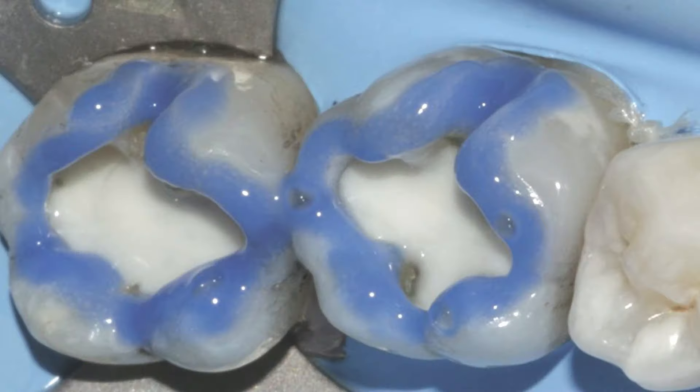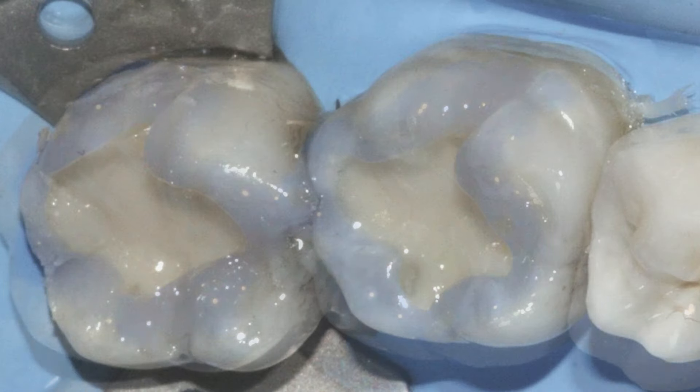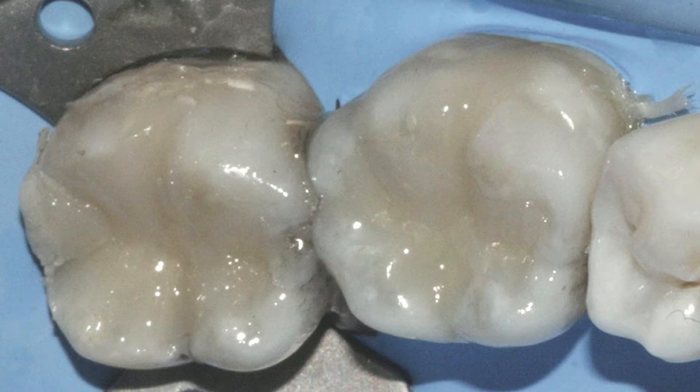Then we're going to evaluate the preparation and how much enamel is left on the tooth. We can see a ring of enamel, so we're going to use a selective etch technique — etch the enamel and then rinse that off. Then we're going to use our bonding agent, light cure that, and then restore the tooth — in the posterior, usually with bulk fill. And here is our final restoration.